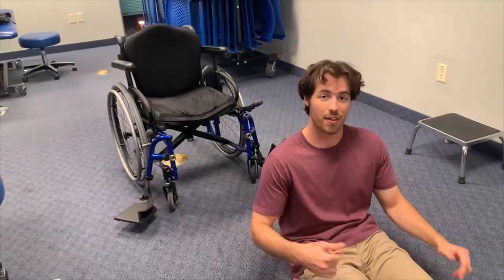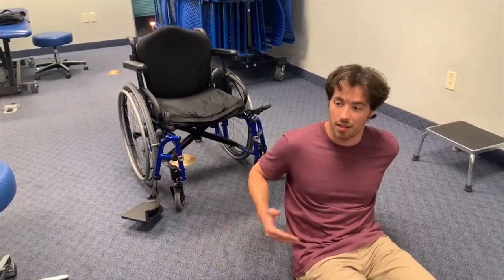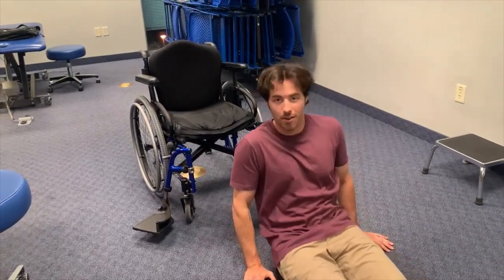Alright, so if you find yourself down on the ground and you're paralyzed from T10 below, what you're going to want to do is try to drag yourself back to your wheelchair, and the most efficient way to do that is going to be dragging yourself backwards, kind of like this.